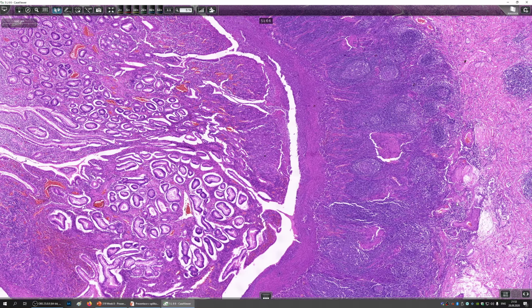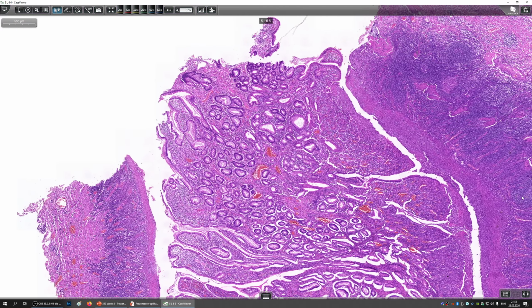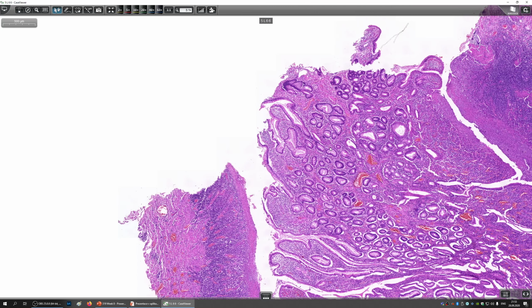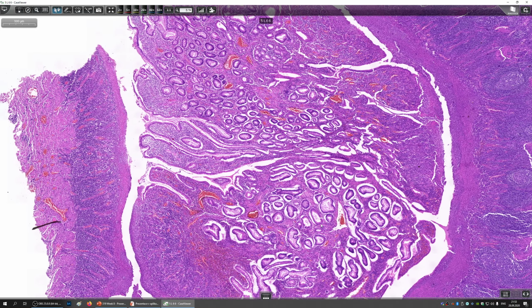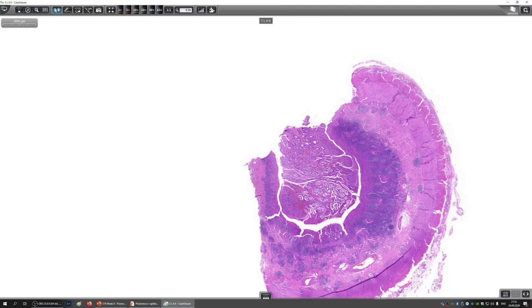Remember, the intestine looks totally different. Once again, just check out some normal pictures and you will see the difference. If you weren't really in knowledge of the origin, then you wouldn't be able to say that this is probably the small intestine. At least that is my guess. But there are very heavy chronic changes, both acute and chronic changes. So remember what I've told you about these diseases.